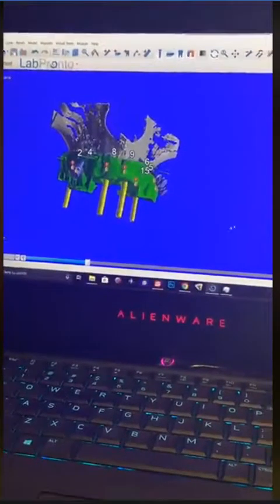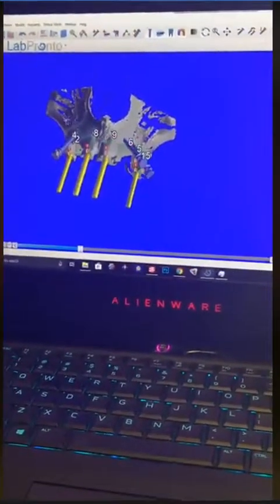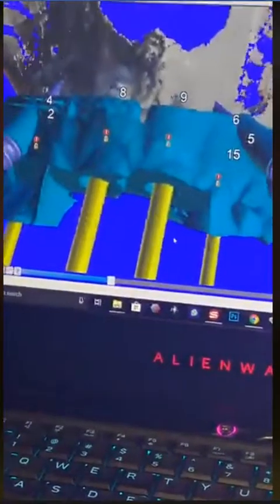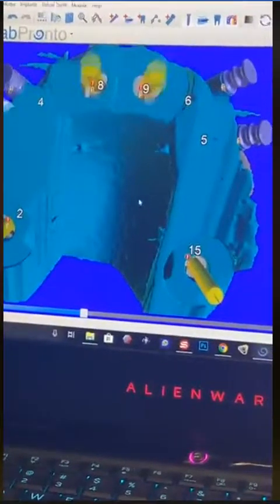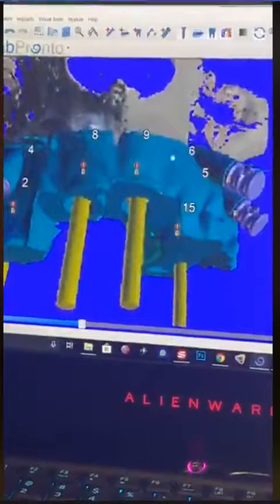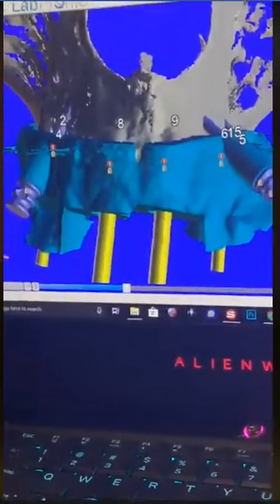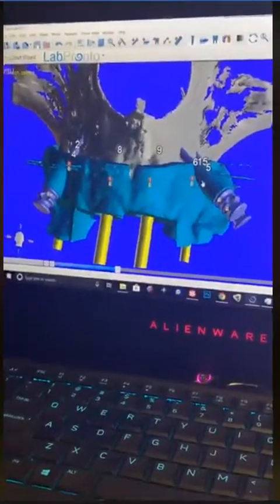So after that, I apologize, let's put this one. After that, I will go ahead and make the guide. Here's the guide, okay? This is exactly a copy of what you just saw and I showed you that we did the surgery on, okay? But I want to tell you what Blue Sky Bio actually recommends. They do have a cylinder that sits on your fixation pin.